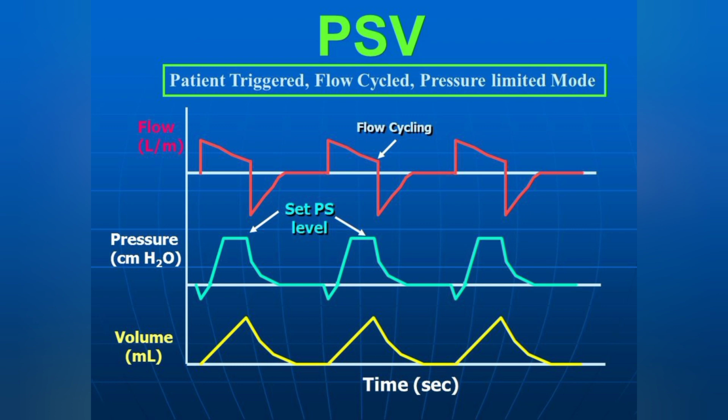After that, PSV. PSV mode is pressure support mode. Pressure support ventilation is a mode of positive pressure mechanical ventilation in which the patient triggers every breath and the ventilator supports those breaths to attain the ideal volume or pressure.